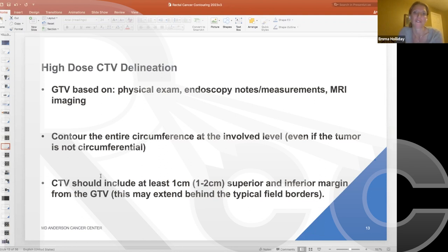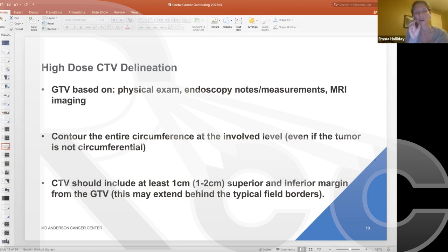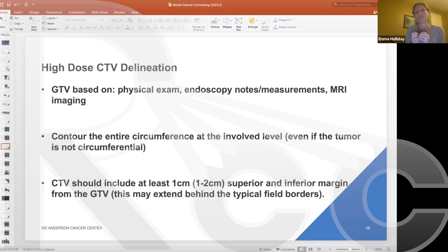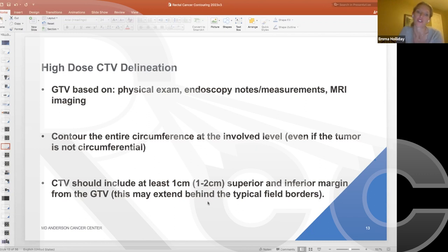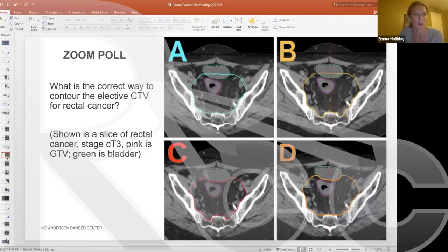The first step in generating a rectal cancer plan is outlining the GTV using all available information — physical exam, endoscopy reports, and axial imaging. An important tip: don't contour the GTV too narrowly. Include the whole circumference of the rectum at the involved level, so that day-to-day variation in gas or stool doesn't result in missing GTV coverage. In terms of extent, include at least 1 cm superior and inferior to the GTV — this may push the superior border higher for a recto-sigmoid tumor or the inferior border lower for a low rectal tumor invading the anal canal.